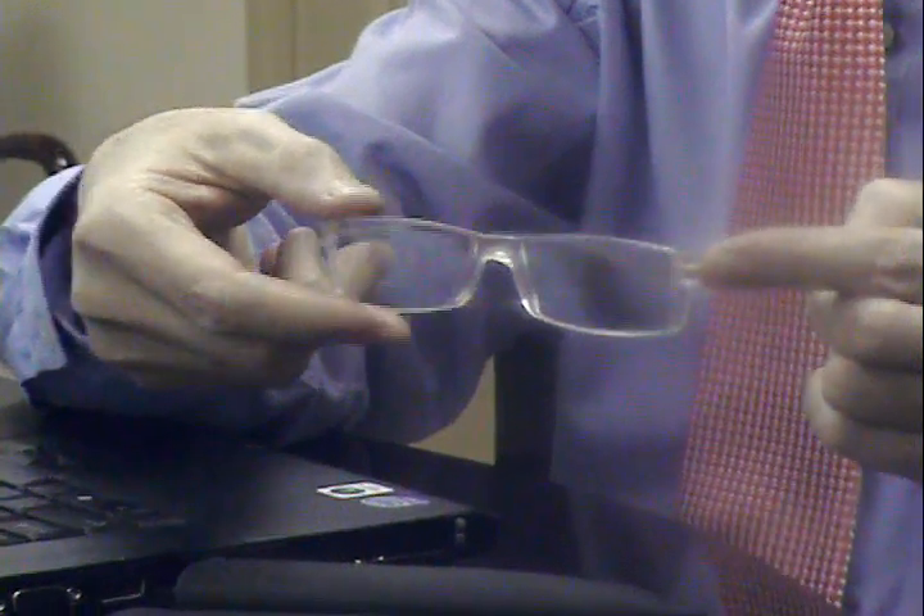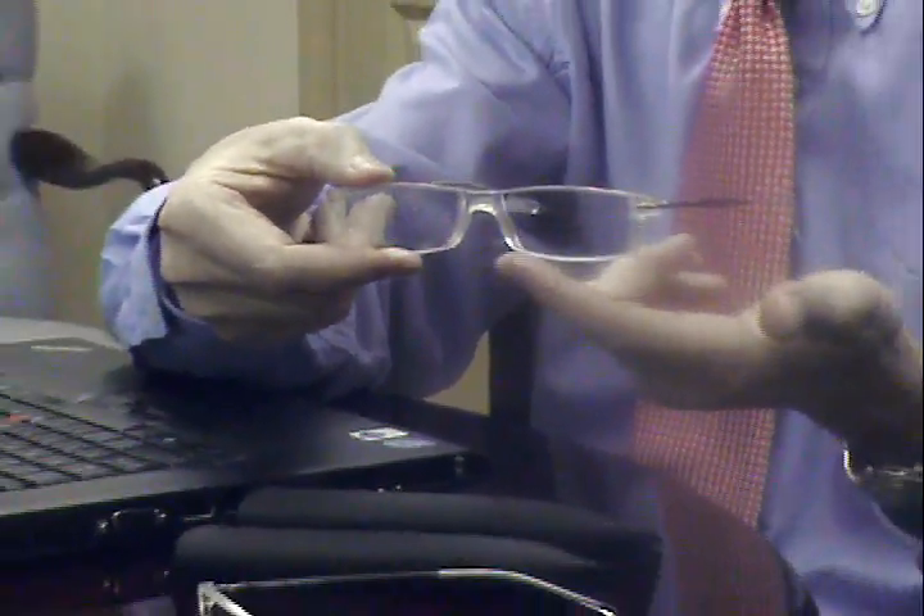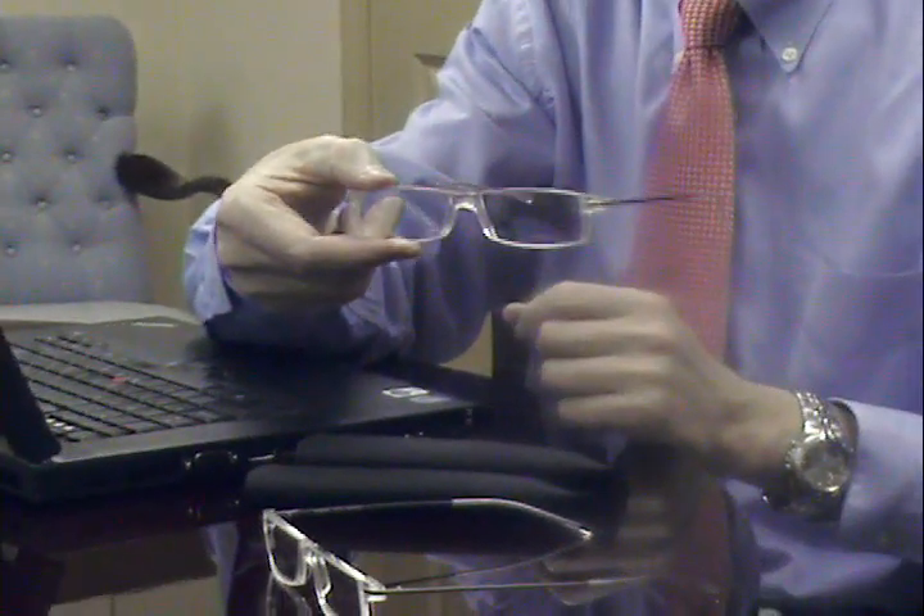Now the frames are quite stylish. They come in two different colors and have a nice open saddle bridge that allows them to be very comfortable when wearing.